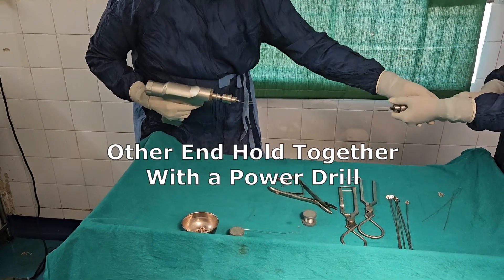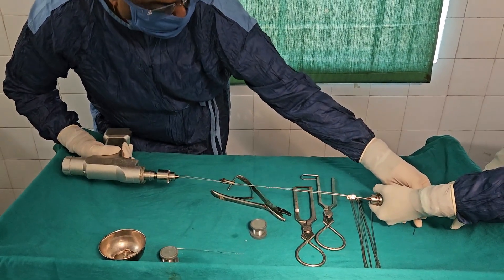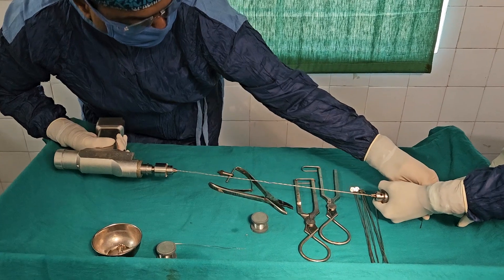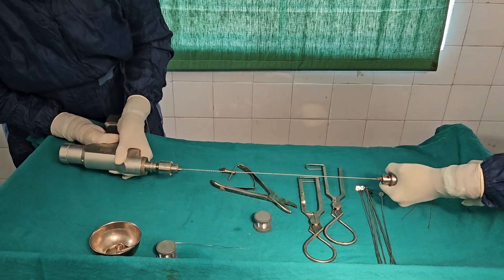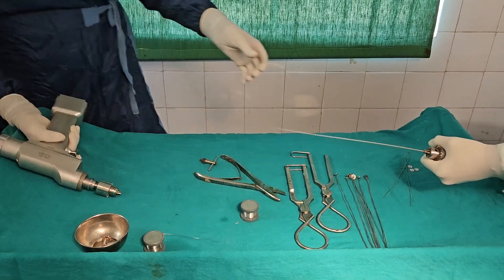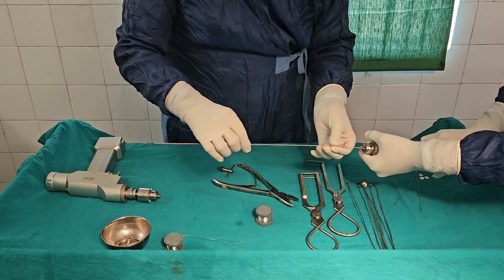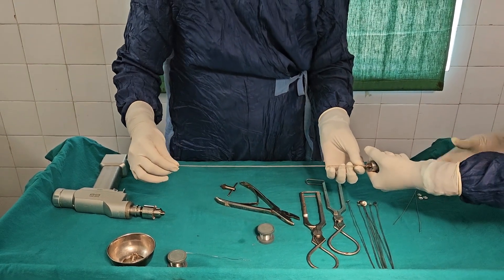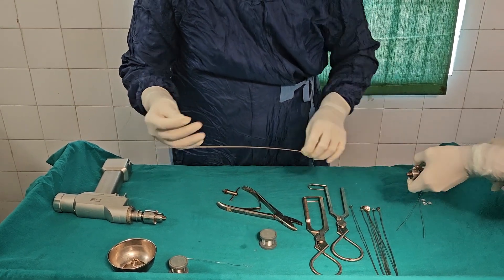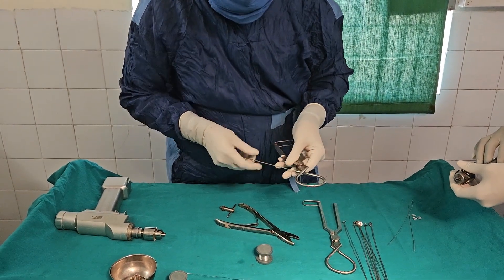Then zoom it up. The assistant uses traction and you can get a uniform cable like this. Sometimes this cable length may not be sufficient.